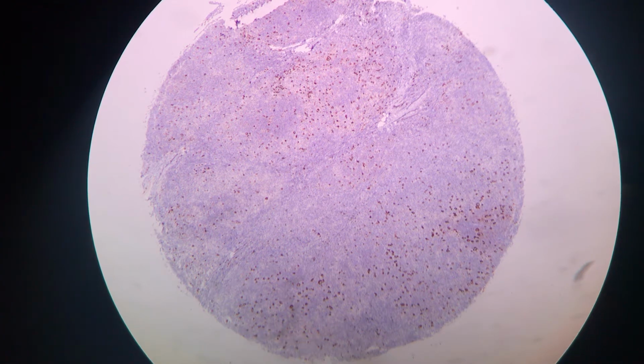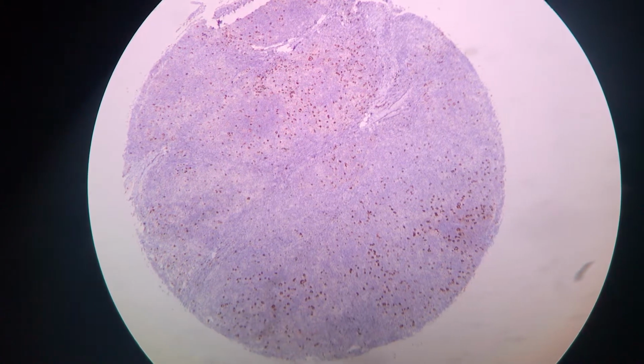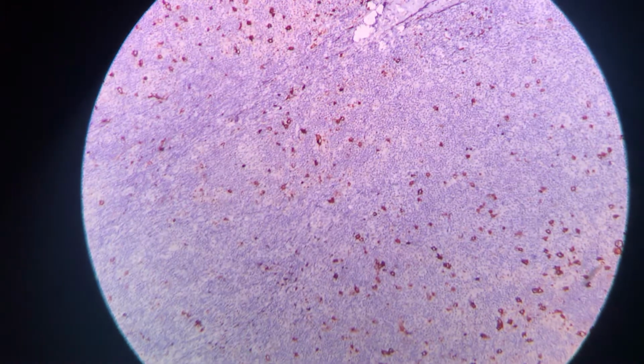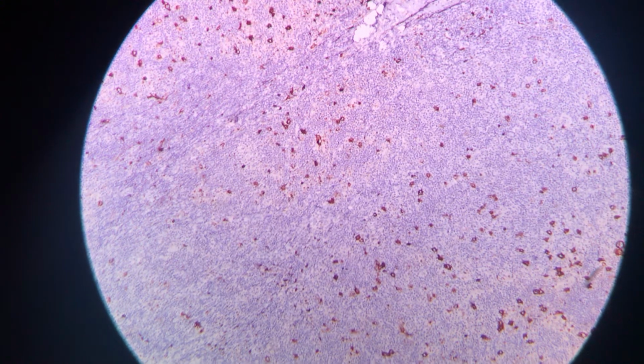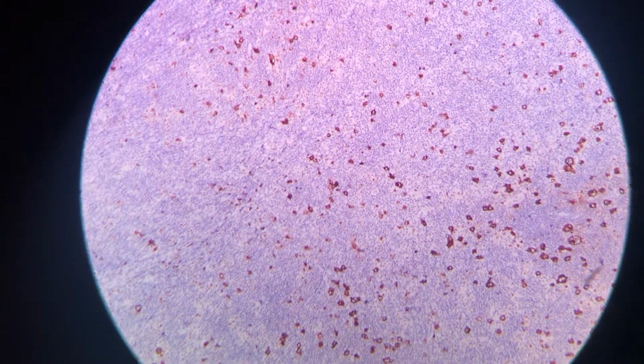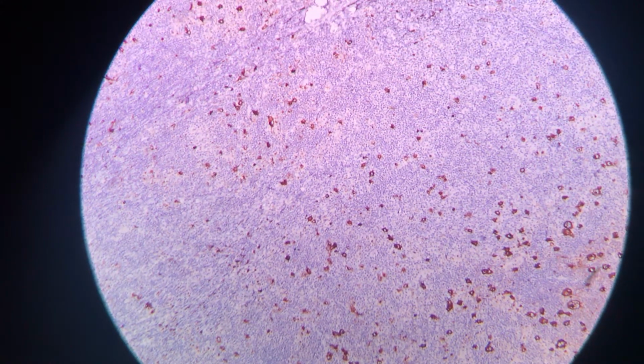Now let's focus on the case of Hodgkin lymphoma. You can see that multiple cells have got dark brown intense staining. If you take a closer look, you would appreciate that they are all scattered cells with intense staining, and on a higher power.